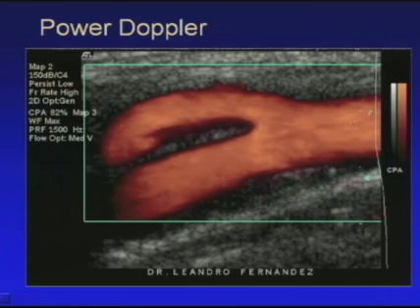Now we have the distal portion of the common carotid artery, we have here the external carotid artery, and here we have the bulb, the proximal portion of the internal carotid artery, and in fact we are observing here a plaque. This is a soft plaque that we can also name fibrolipidic plaque. Those characteristics will be presented in the second part of the lecture.